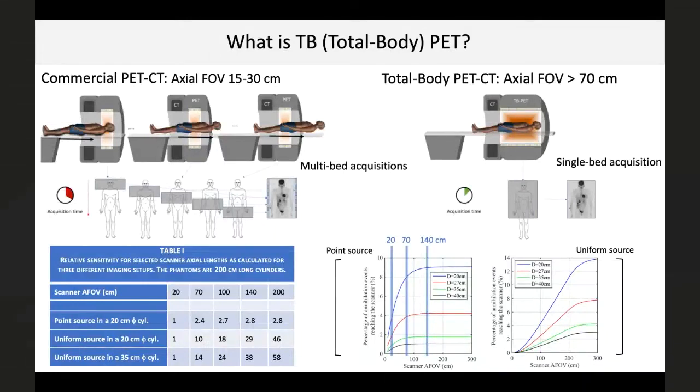So the way that I would express that is that it relates to the ability to reduce the dose, if again thinking about a clinical study or even a research study, or the ability to scan shorter. But again, the signal to noise improvement would be more related to this factor of 3 that we see.